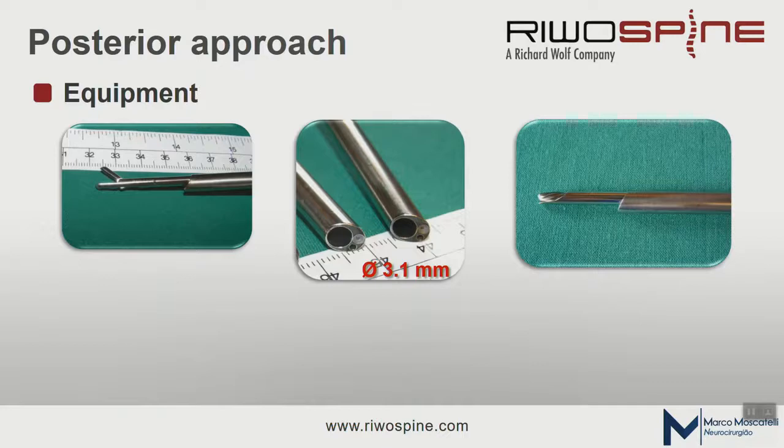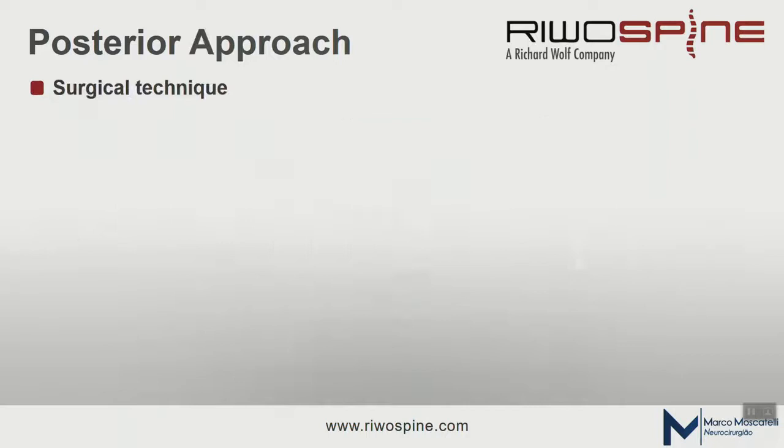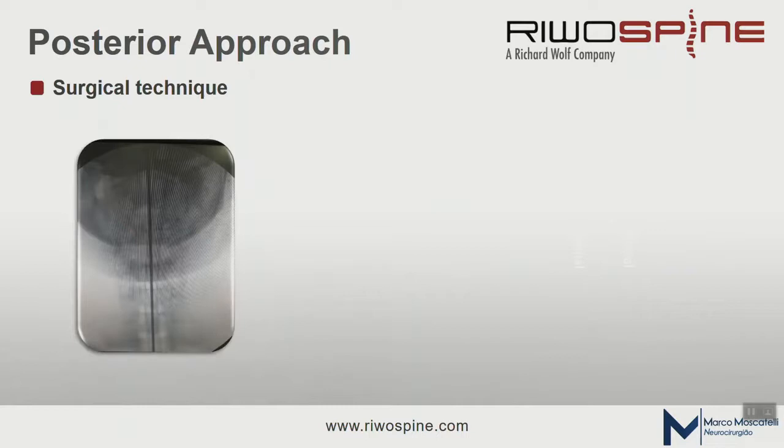Here is the cervical. I will show you the techniques step by step. I don't use a fixation of the head with pins, just a fixation with tapes, so there are no big movements. I find pins very aggressive for the spine. I believe that tape fixation is sufficient.